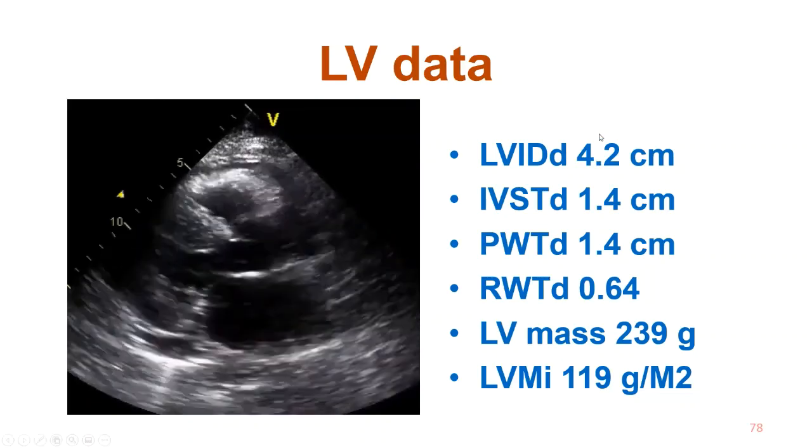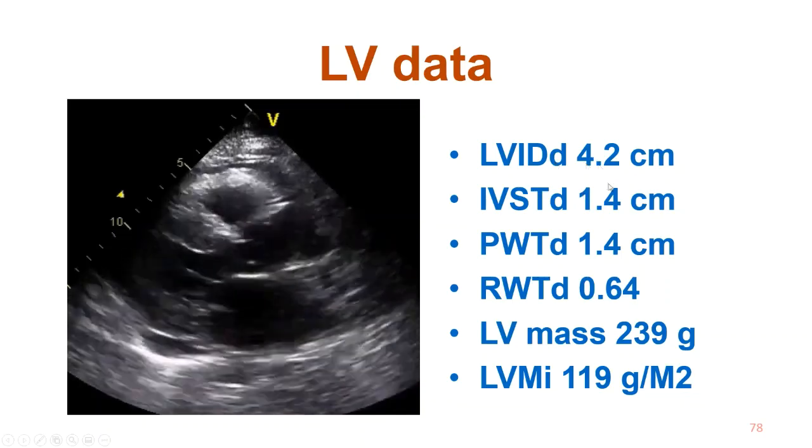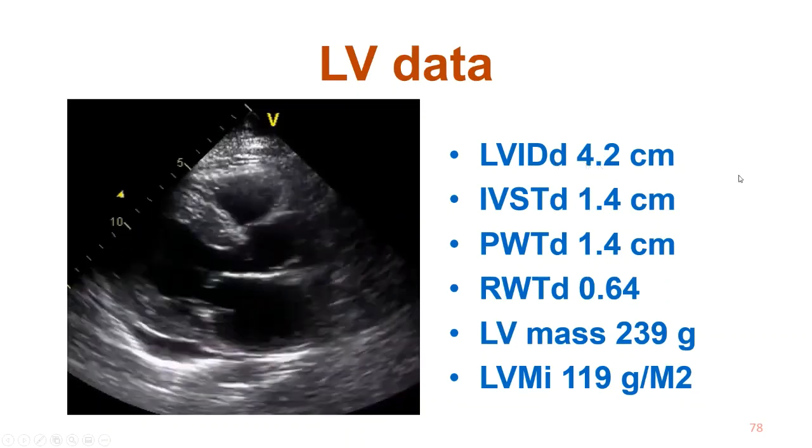So how do we actually compute the left ventricular mass? Well, let's assume we have these dimensions here.